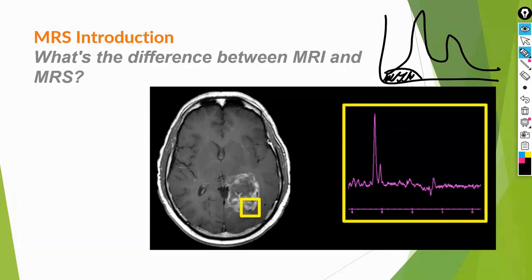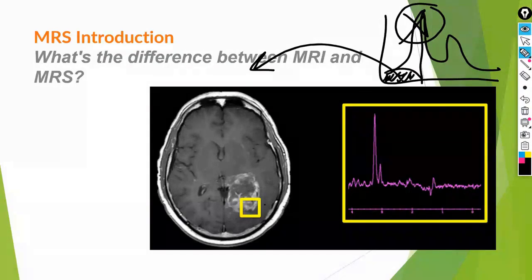Okay, I want to take any signal. How do I take the signal of these metabolites and analyze it to produce a spectrum? You need to eliminate the water signal. How do you know the frequency of the protons in water? You find out at what frequency it resonates and give it an RF pulse before you start the MRI spectroscopy.